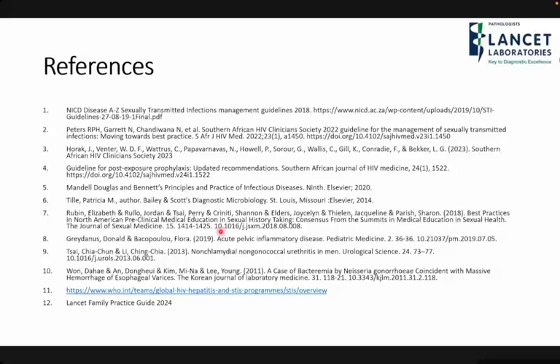And then with regards to the prices, the prices for your gonorrhea and chlamydia is around 1.5 thousand rands. It is expensive, unfortunately. With your vaginal discharge syndromes, where you have 5-6 targets, it is around 2,000. Your genital ulcer disease is a bit expensive. It's more expensive than your vaginal discharge syndromes.